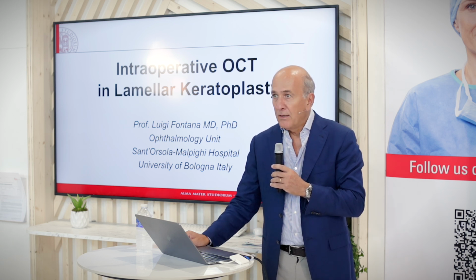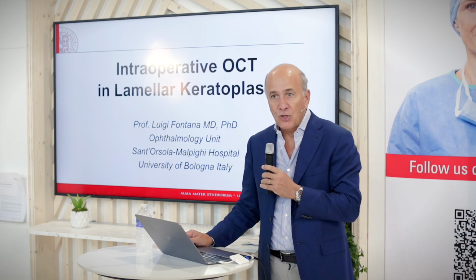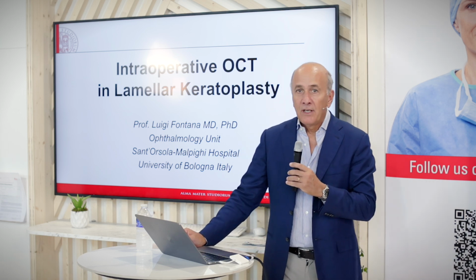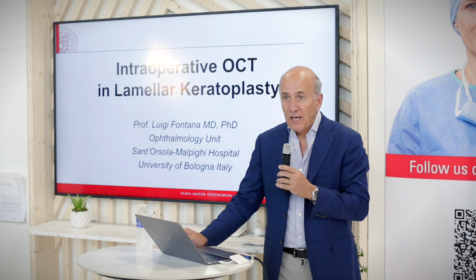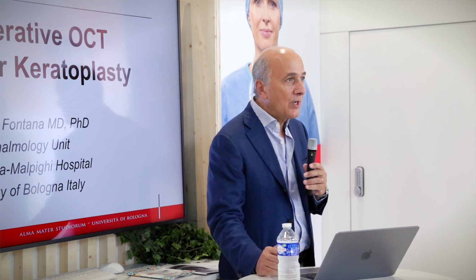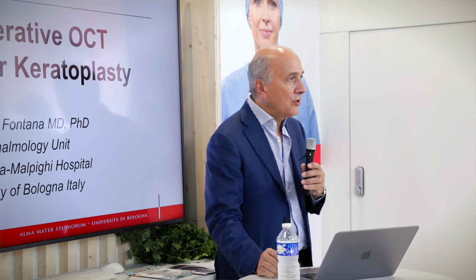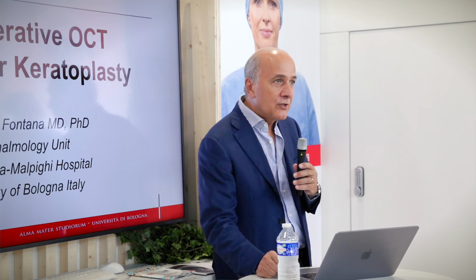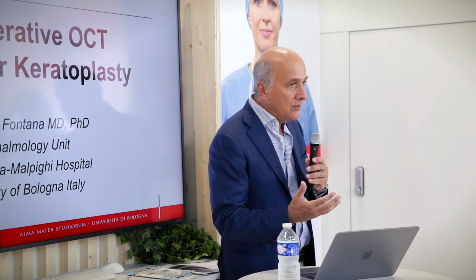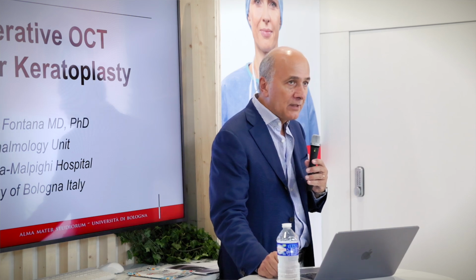Now, I may assume that you are interested in cornea transplantation. And the first question I ask you is whether you have an OCT applied to a microscope in your operating rooms. So what I'm going to do is try to convince you that intraoperative OCT is not a waste of money, is not a waste of time, but is a real revolution in terms of surgical application for aiding a cornea lamellar specialist, and not only those.